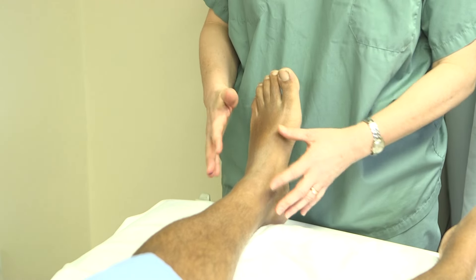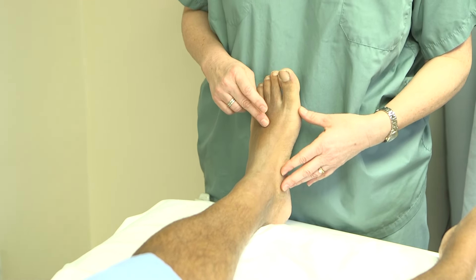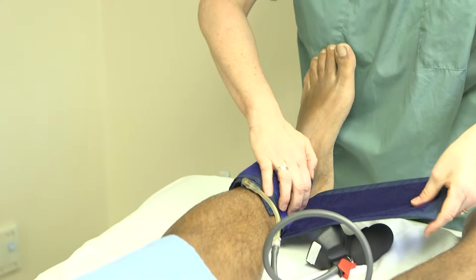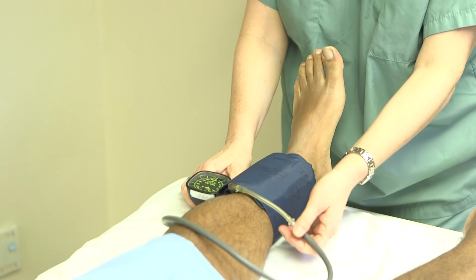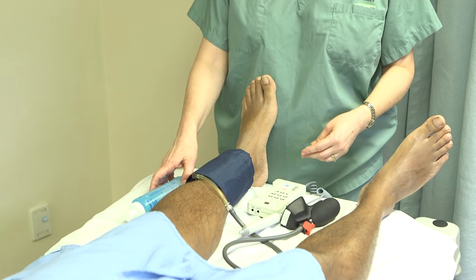I'm going to repeat the procedure by applying the blood pressure cuff, and we're going to again look for the pulse signals using the handheld Doppler to acquire our ankle pressure measurements. First, I'm going to apply the blood pressure cuff to the ankle. Now we're going to apply some ultrasonic gel to the dorsalis pedis pulse.